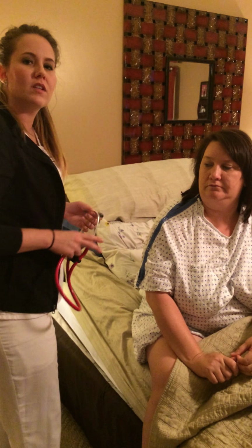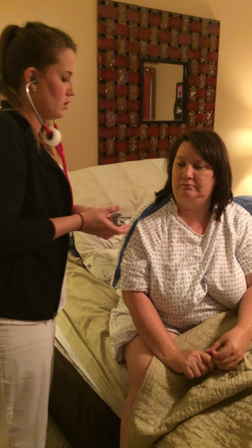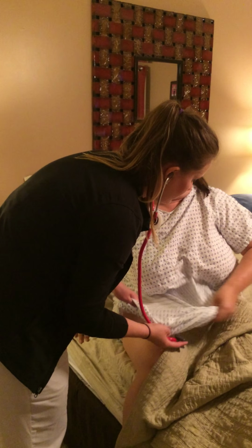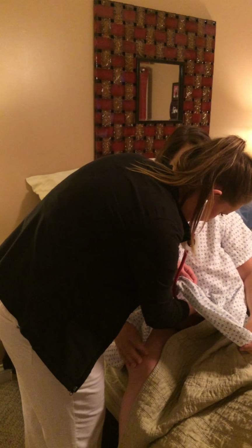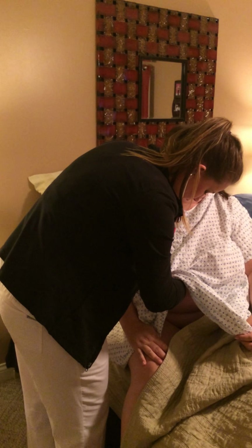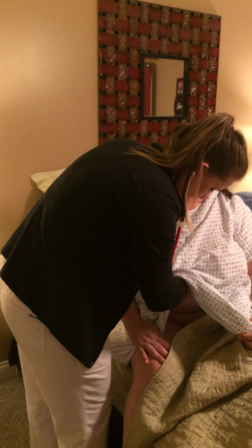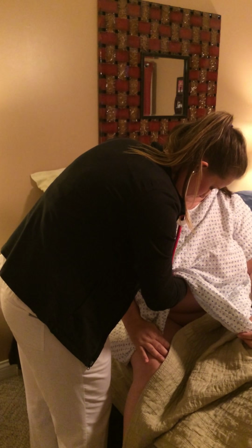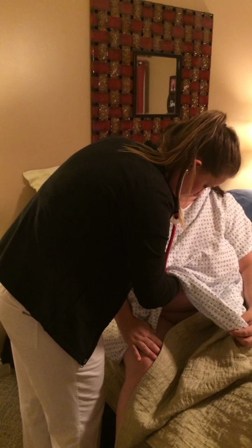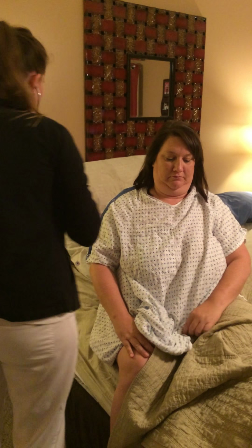I'm going to go ahead and listen at this time while the patient is sitting up, to the apex of the heart, to see if I can hear any murmurs. So I'm just going to slide under the patient's gown. I'm going to keep our privacy for this video. And I'm going to listen to the apex of the heart. Everything was within normal limits. I'm going to have you lay back down now.